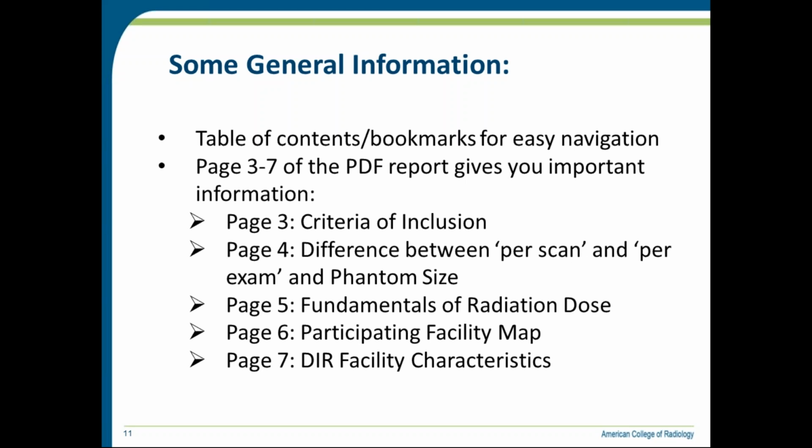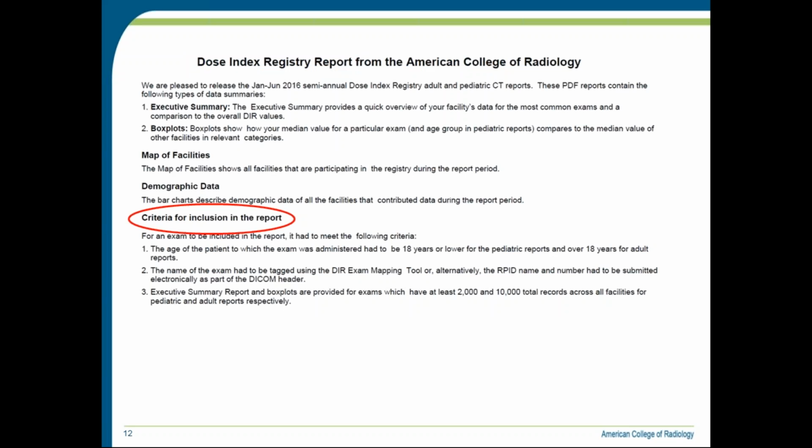And if you are a facility that joined DIR recently, or you are someone who is attending this webinar for the first time, or have been managing your DIR or doing this registry, then you might have some questions, and many of these questions can be answered using the information that we provide here. So please go through that. These are important. You can see here, page 3 of your PDF report shows you the criteria of inclusion in the report.